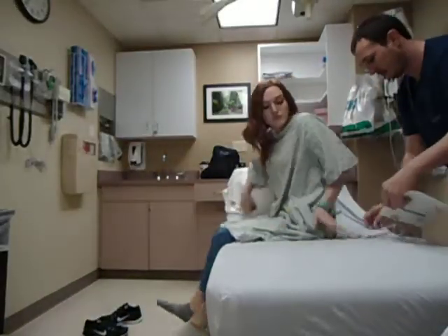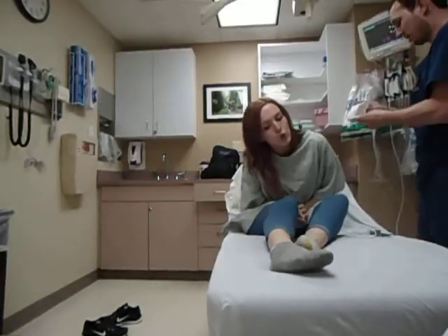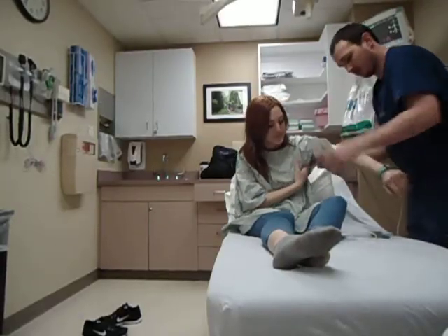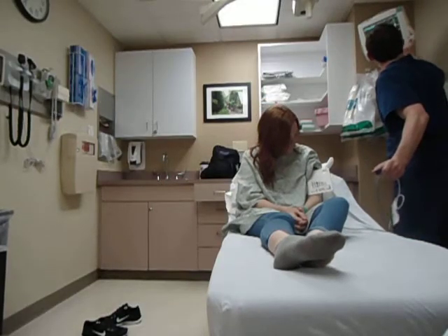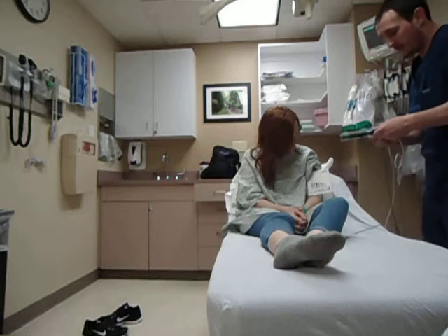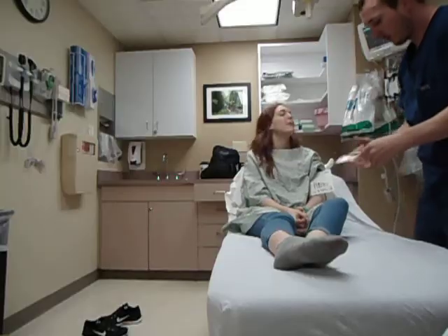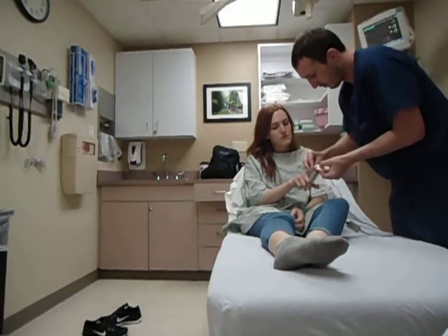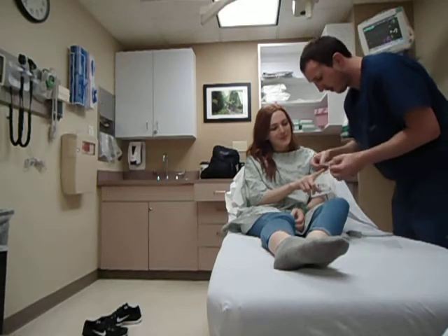Okay. And then I'll have you do your blood pressure here. Go ahead and do your oxygen here. Let's take that off first. Helps a little bit that way.